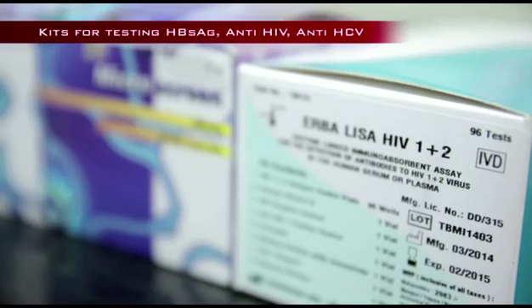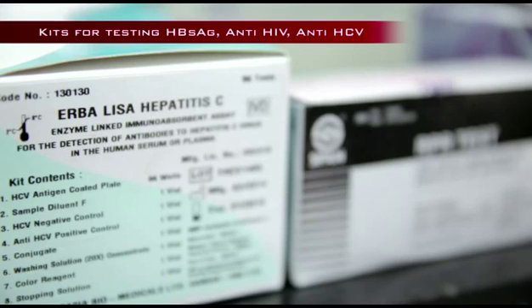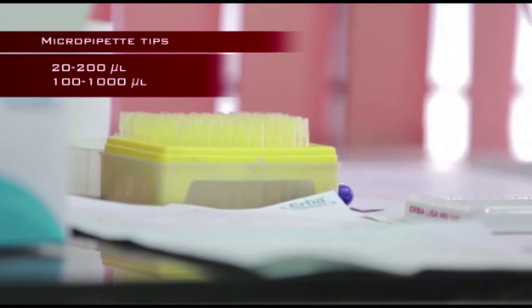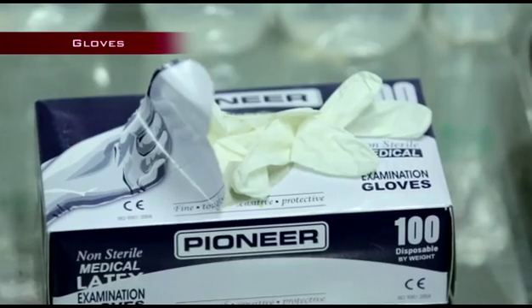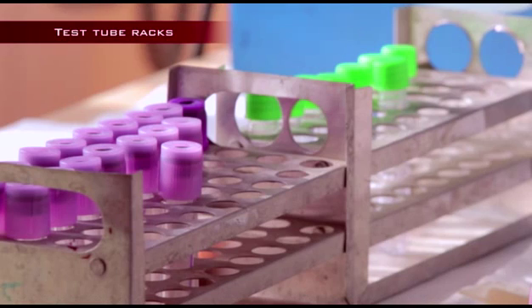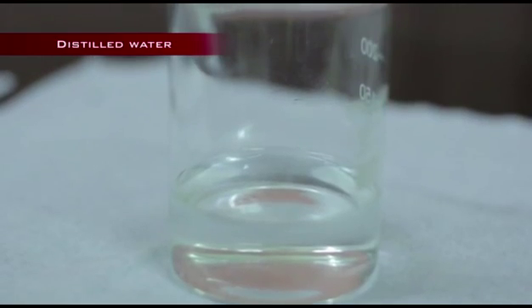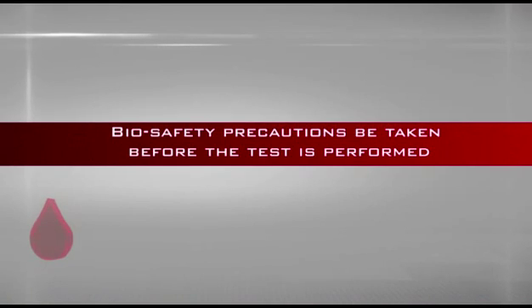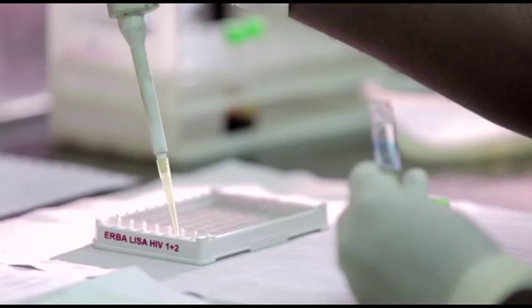Consumables: kits for testing anti-HIV antibodies, HBV surface antigens and anti-HCV antibodies. Micropipette tips 20 to 200 microliters, 100 to 1000 microliters. Gloves, test tubes, test tube racks, 1% sodium hypochlorite solution, distilled water, tissue paper, marker pen. It is important that biosafety precautions be taken before the test is performed. We now proceed to see how the ELISA test is performed.